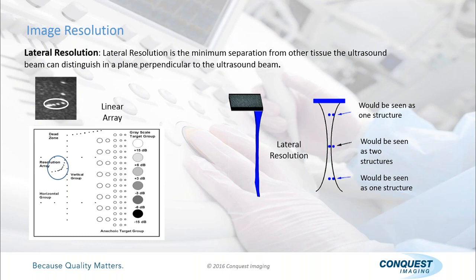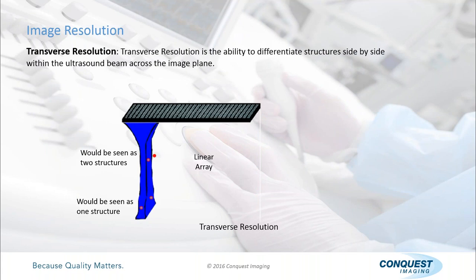It's also important to know, and you'll see me mention it many times throughout this presentation, that you need to take hard copy printouts as you look at these different probes, different frequencies on a phantom, because what you're really looking for is degradation over time. So if 6 months earlier you had taken hard copy printouts and the same probe, same frequency, same preset looked better than this, then you know that there's been degradation, and you must investigate why at that point. What's changed on the system to cause this change in resolution?